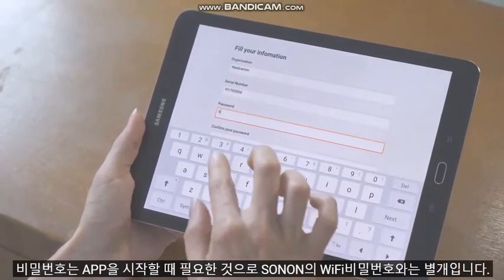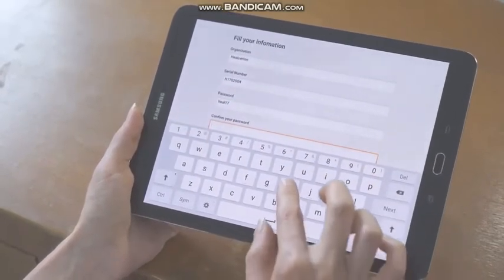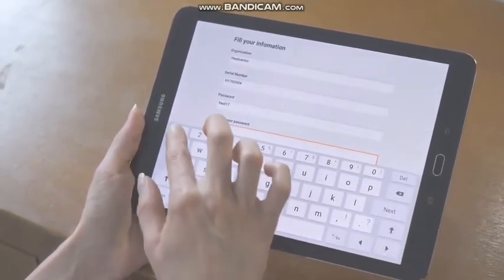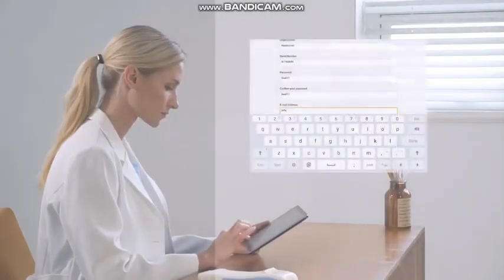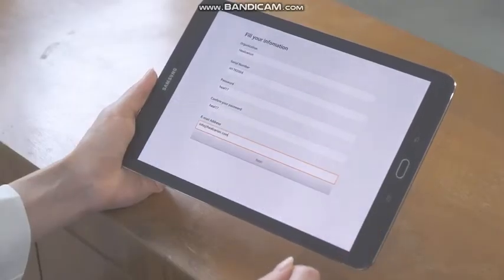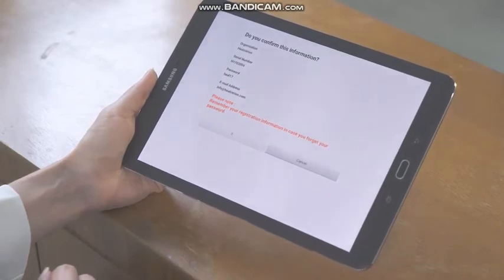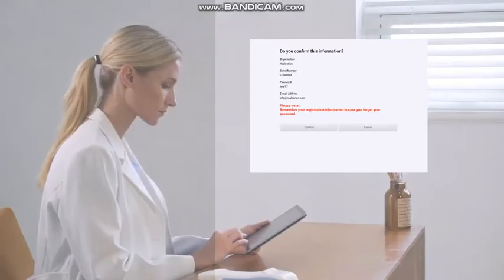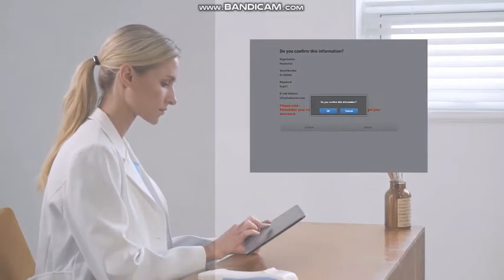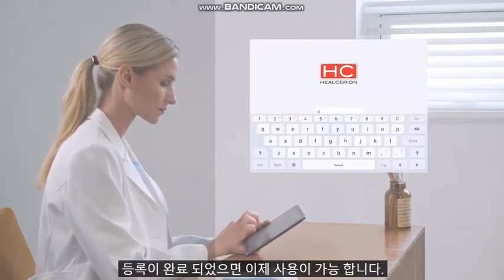Please note that the password on the app is different from the Wi-Fi password. Once you complete the registration process, you are ready to scan anytime.